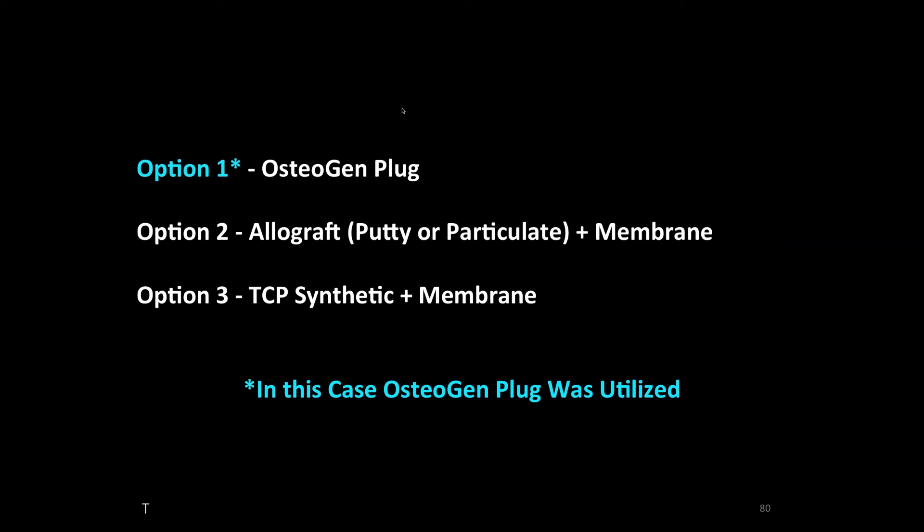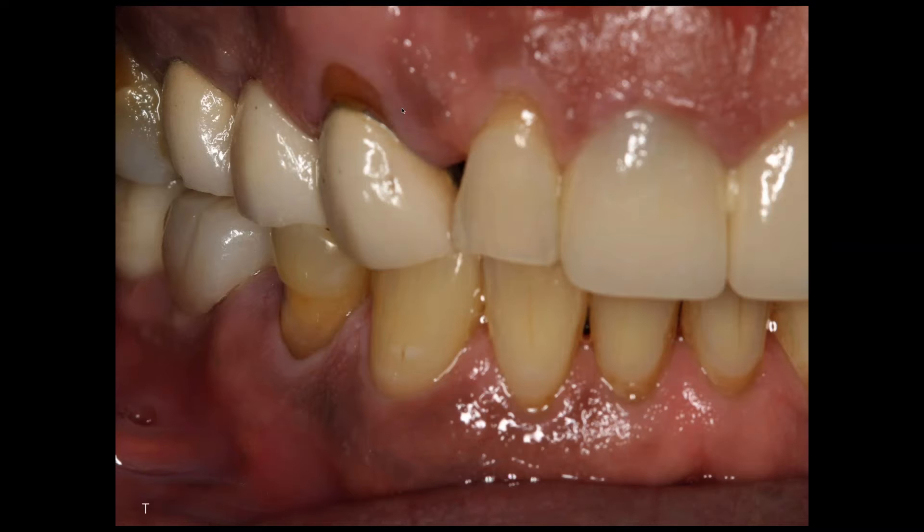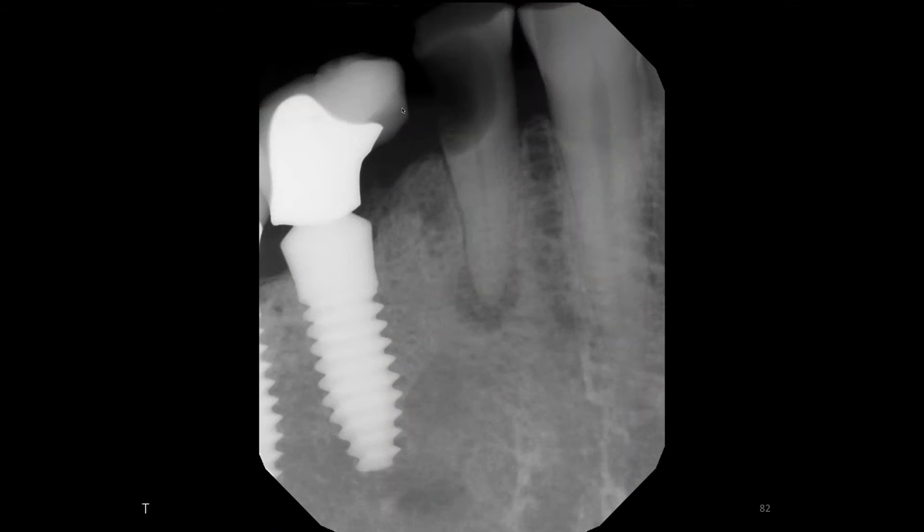You can see the older implant crown in the back — that was done somewhere. And we want to remove this tooth without damaging the adjacent implant or crown and the adjacent worn teeth.